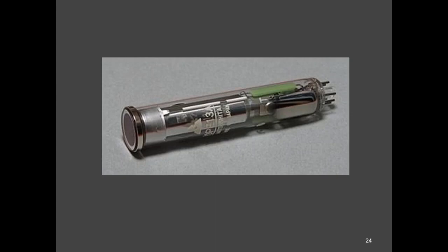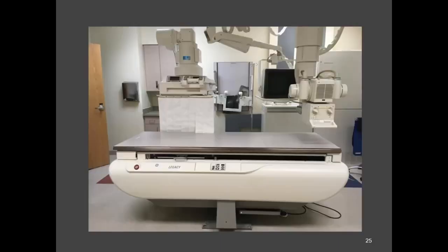Here's a pickup tube. This would be the cathode, and this would be your anode, your output. The other aspect on those old pickup tubes is they typically gave you a warning when they were going to die. They would start doing intermittent stuff, or sometimes just stop. Yeah, especially the circle of death. You can see the circle of death and you know they are going to be changing the pickup tube. So here's an old legacy system that uses a pickup tube for its camera. And like I said, the PAs, up until they got their new digital system, actually liked this room better than the next generation after it.